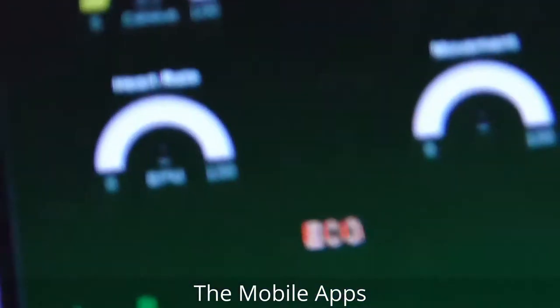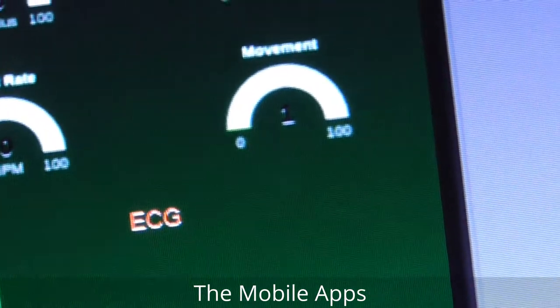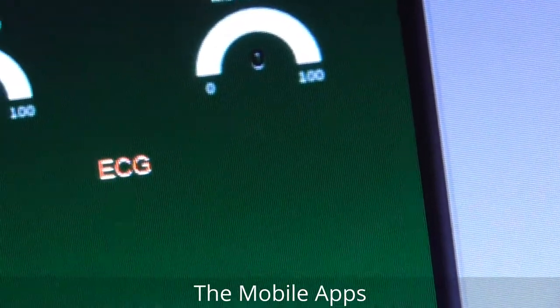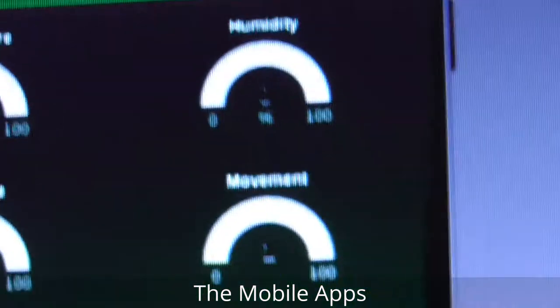Now the movement — if I move, it goes to one, counting the huge movement. Now it's zero. It's a very sensitive sensor.